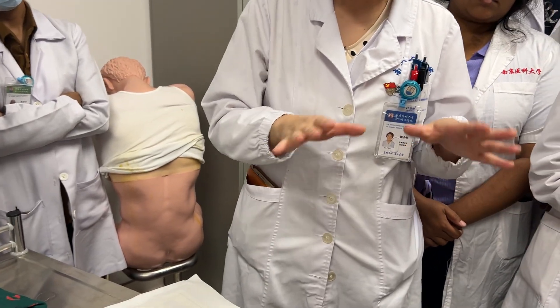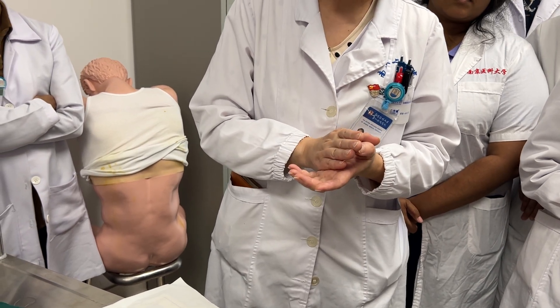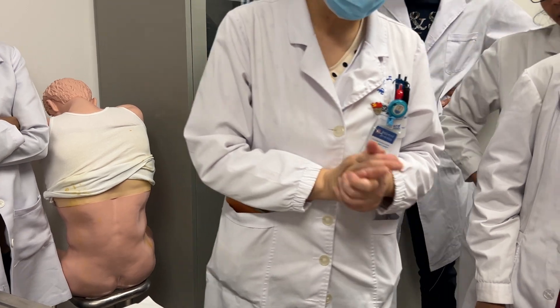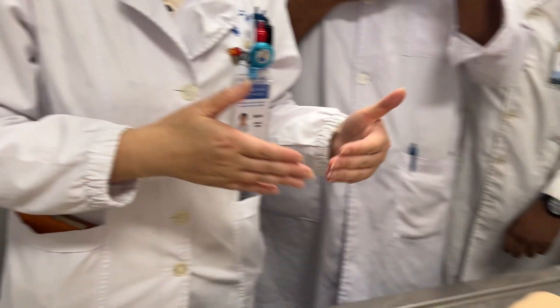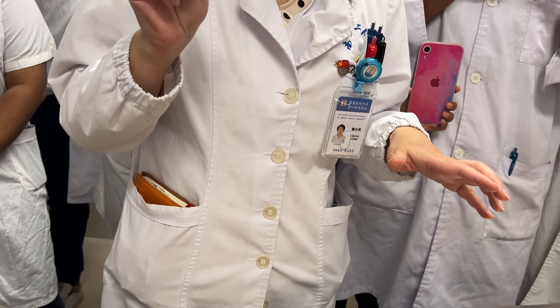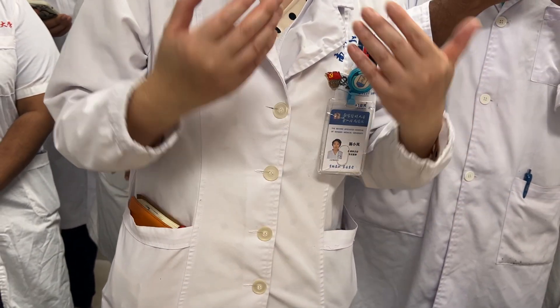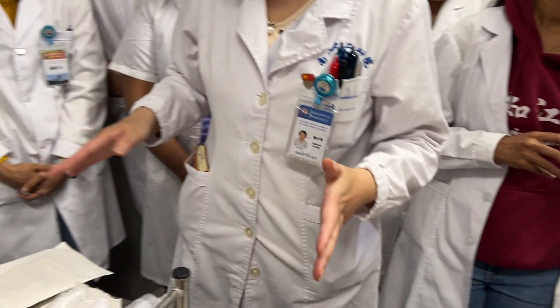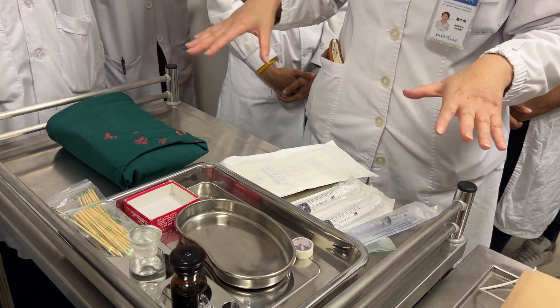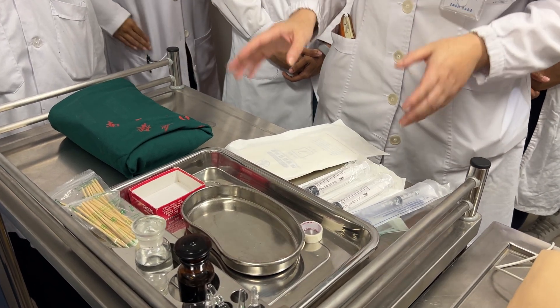We should get the permission of the patient first and get the signature from the patient, then talk about this operation with the patient — how it is done, that the patient may have some pain and bleeding, and ask them to relax. Then we must do some preparation and all the equipment must be prepared.